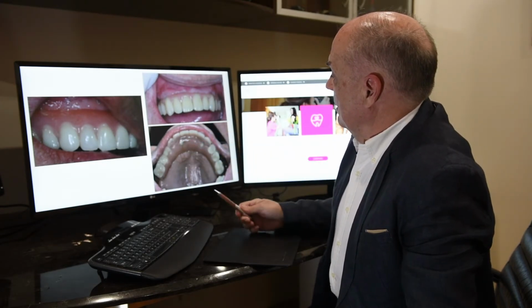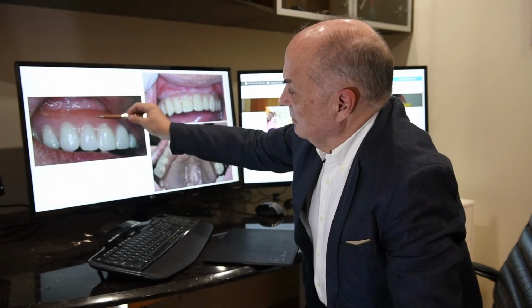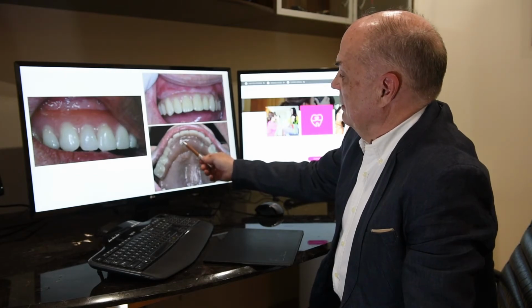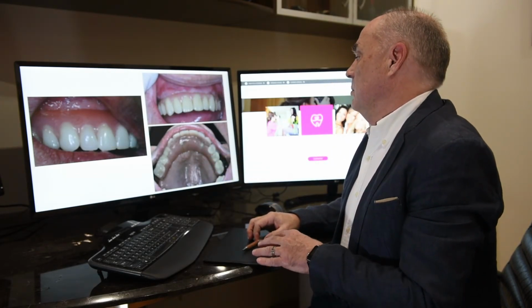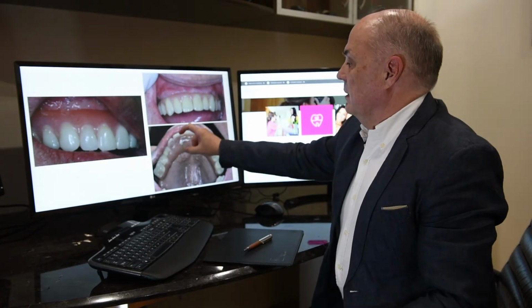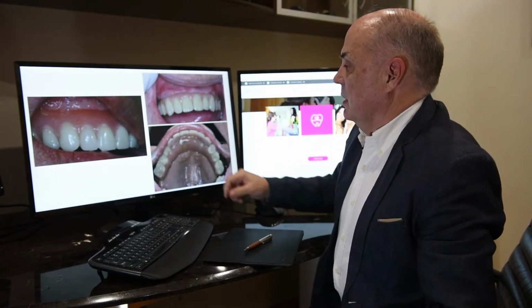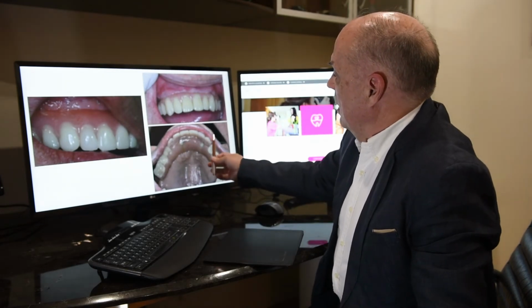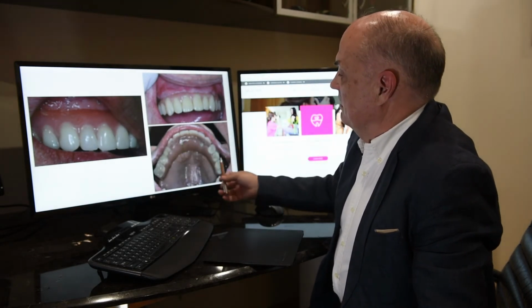Now another disadvantage is they're difficult to clean underneath. As a practitioner, I can't inspect these implants. I can't check if the implants are healthy because we have a big piece of plastic that's overlaying the implants. I can't probe the implants, I can't look at the implants, I can't look at the colour of the implants, and I really don't know what's going on with the implants.